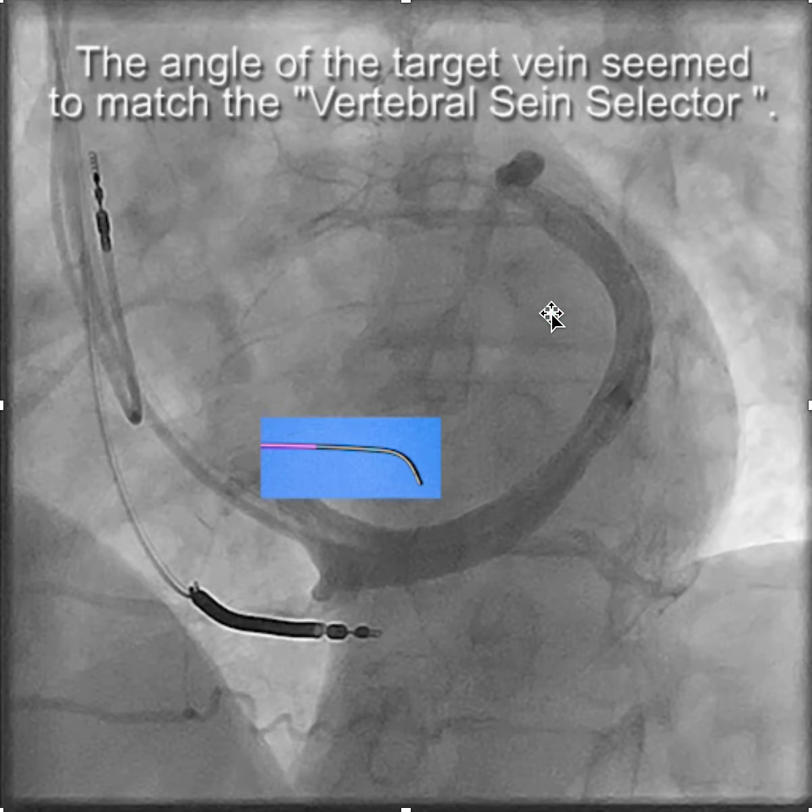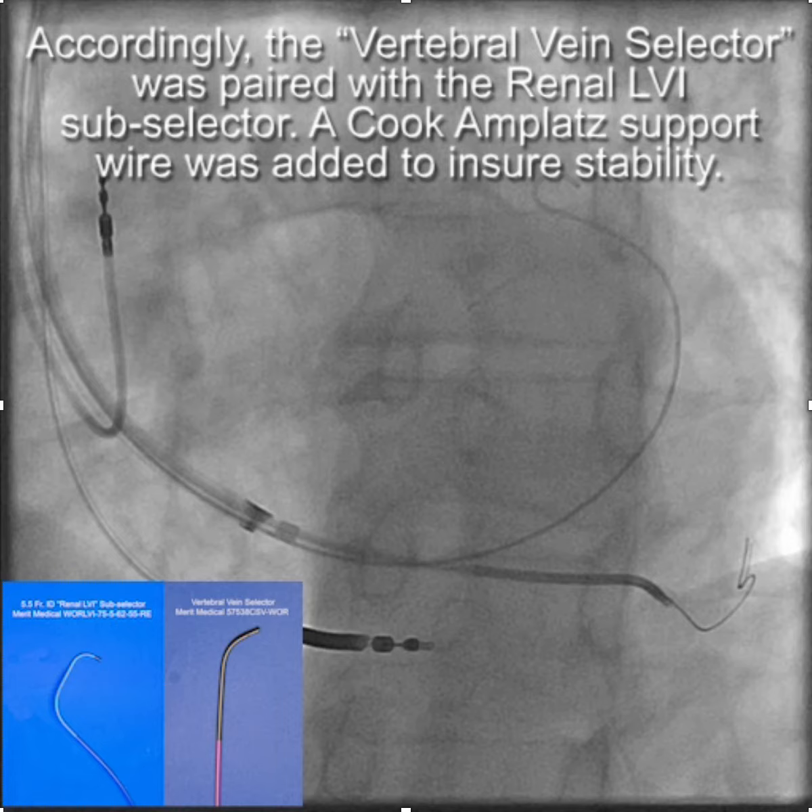Rather than just throwing a lead in, we decided to use the telescoping delivery system. You choose the vein selector to try to match the angle of the takeoff of the vein you're going to put the lead in. You can see here that the branch that comes off down near the CS has a rather flat angle, which matches nicely the vertebral-shape vein selector.